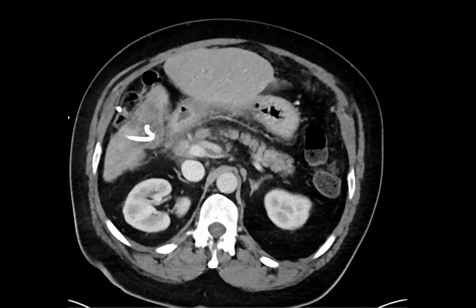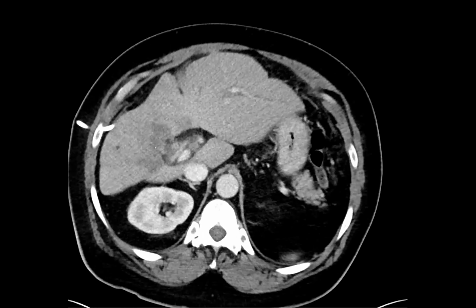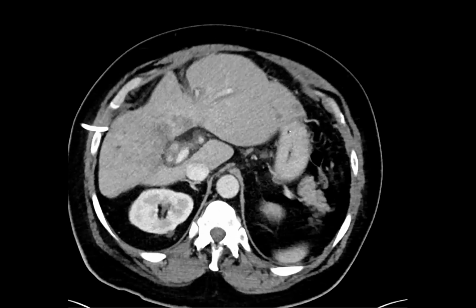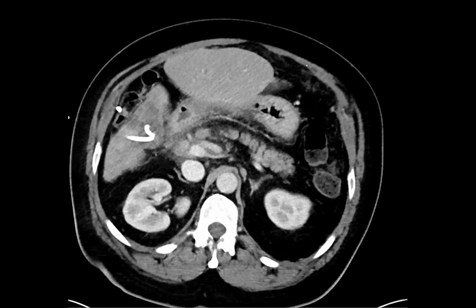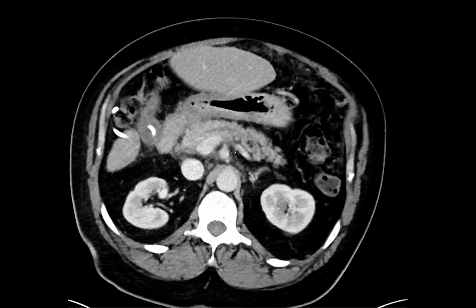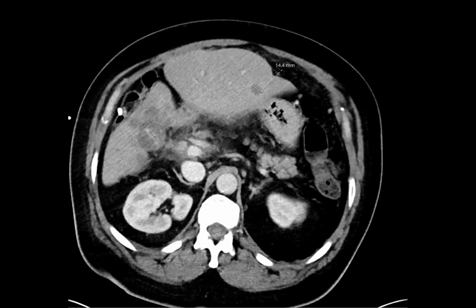here's the drain. And now you can see even better on this post-contrast exam, it's doing what gallbladder cancer loves to do, which is directly invading the adjacent liver, because there are veins and lymphatics that directly drain into the liver. And we're now developing some intrahepatic lesions. So it was rapidly progressing, and these were intrahepatic metastases. The omentum was biopsied, and this came back poorly differentiated cancer with pancreatic or biliary origin. So just a bad gallbladder cancer, but if you have wall thickening and especially omental disease, really think about gallbladder cancer.